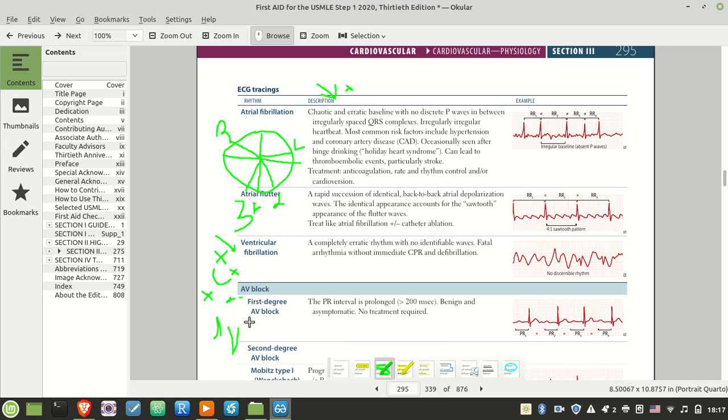And of course, if you have a negative charge going away from something, that's a negative times a negative, that's a positive. And if you have a negative charge going towards something, then it's a negative times a positive, that's a negative. That's how to read EKGs real quick without going into much detail, but there you go.